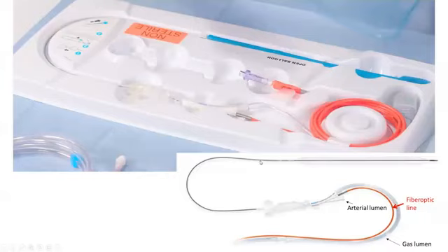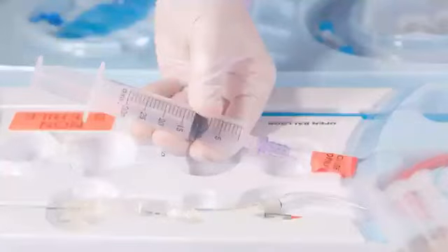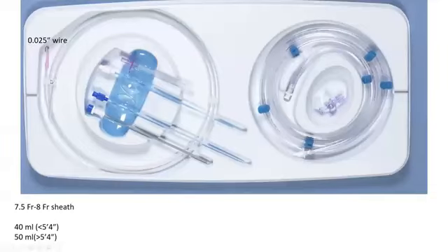The body of that balloon, do not dip it in water or saline, and do not wipe it. If you wipe it, you increase the chance of it unfurling, and it may become hard for it to be advanced through that 8 French sheath, okay? So do not dip it in water. So what you do, you advance it without having been touched with fluid, and with dry hands, you advance it using 1 inch. You put your finger 1 inch behind, and you push with 1-inch steps up until you get it through.